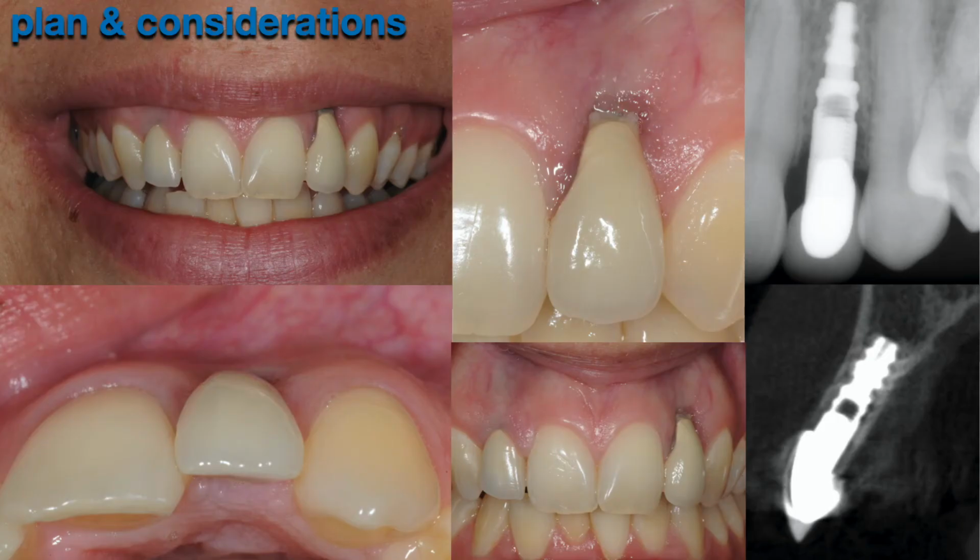What's bothering you? There were a couple of things that bothered her. Not only was the metal collar exposed, but the tooth was so much narrower than the symmetrical tooth number 7. The width of this number 10 lateral incisor was only 5.5 millimeters maximum of the clinical crown. She didn't like that. So obviously a thought process is, would you get involved with orthodontics? Because orthodontics is going to set the site for us clinically and give us adequate space. How much space do I ideally want? 6.8, 7 millimeters for the width of a lateral incisor.